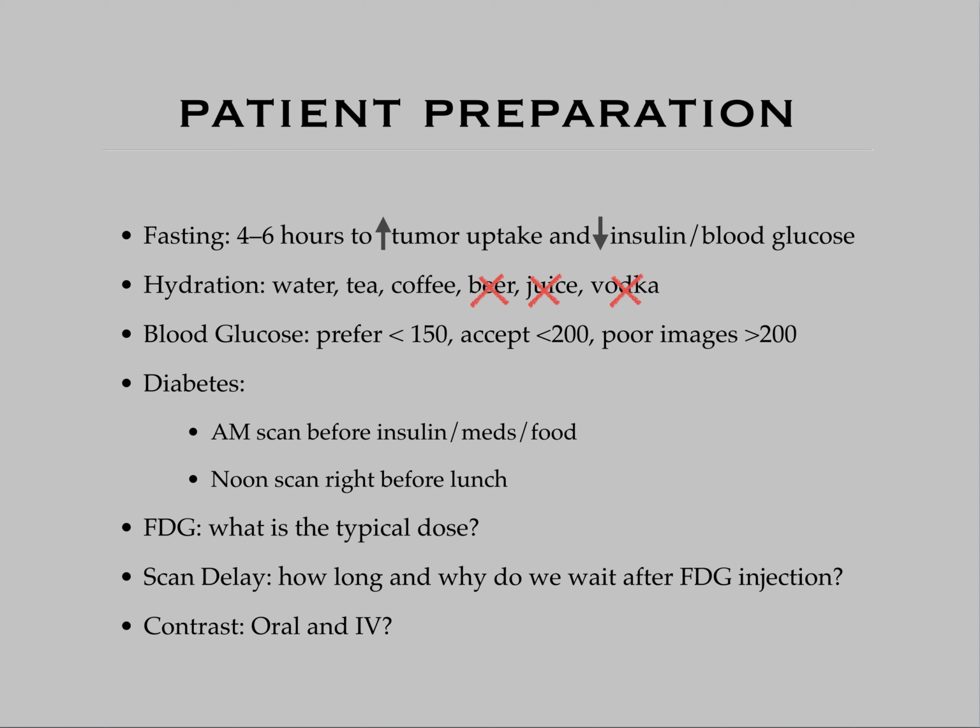the success is modest. For patients that are slightly more compliant, the better strategy is to do the scan at noon, right before lunch, so the patient would have the morning dose of insulin as well as the breakfast, and then to be scanned at least 4 hours after the breakfast before the lunch. And that strategy usually results in the lowest blood sugars in a diabetic patient. For patients on insulin pumps, that requires a whole different discussion.